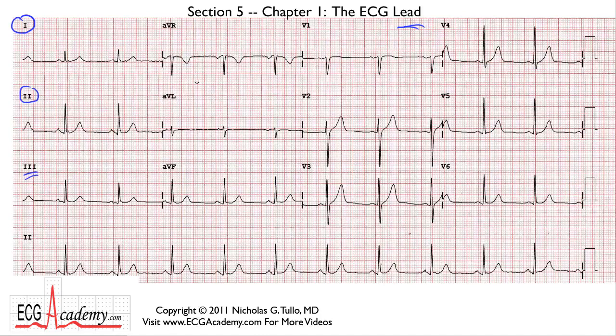In the intermediate section of the ECG Academy, we're going to be talking about a more advanced concept of the ECG axis. And that involves some calculations, and the axis deviation is a term used to describe an abnormal ECG axis that we'll get into as far as the physiologic disturbances that can result in axis deviation. But again, that's an intermediate concept, and we're not going to be talking about axis, but I do want to introduce you to the concept of the lead.